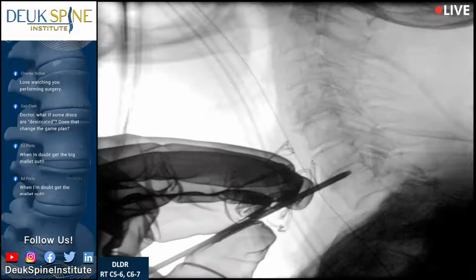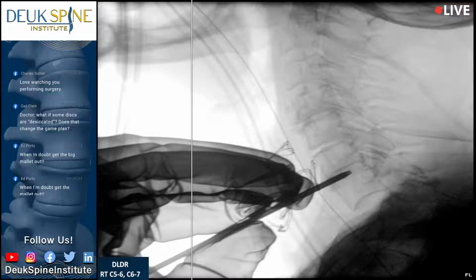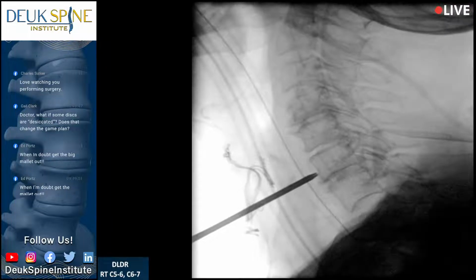Try to get rid of my hand. I don't need to have my hand radiated. Those are things you should do automatically on your own without me asking you. Shot. All right. Coming out. Right there. Shot. We're outside. I want to make sure I'm in the middle.